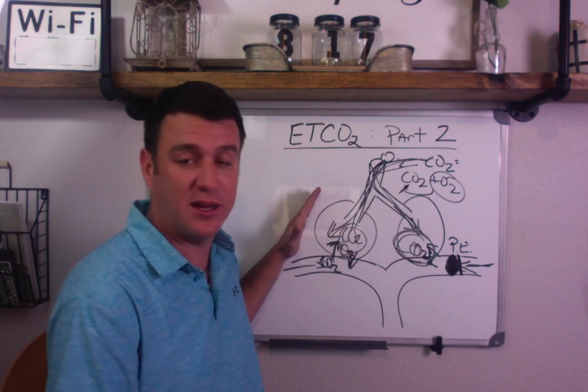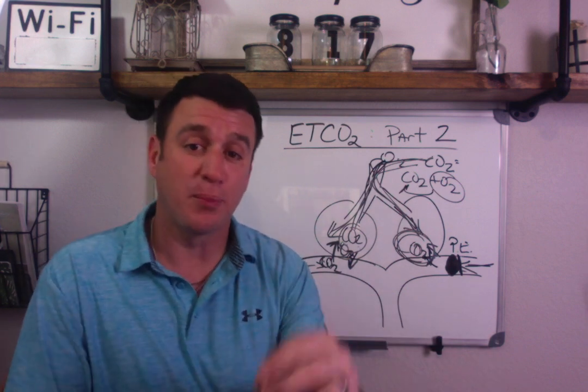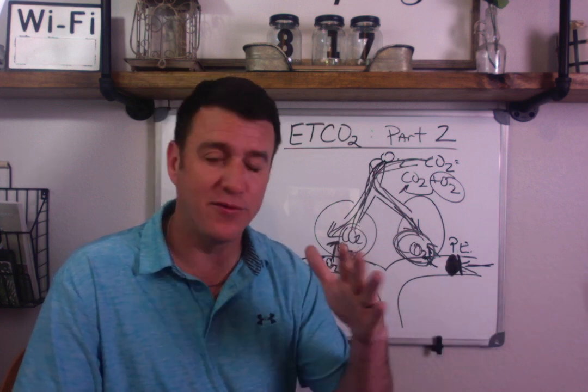And that's why you get a decrease in end-tidal CO2 with the presence of a pulmonary embolism or increased dead space ventilation. Okay, you have got to understand this.